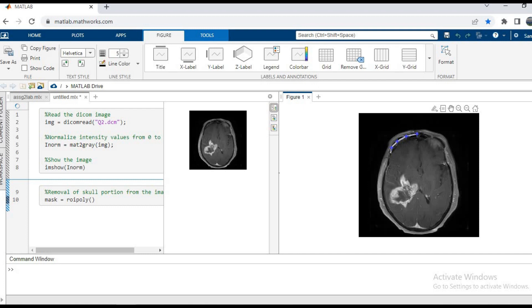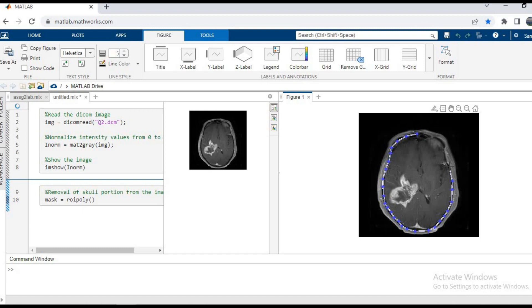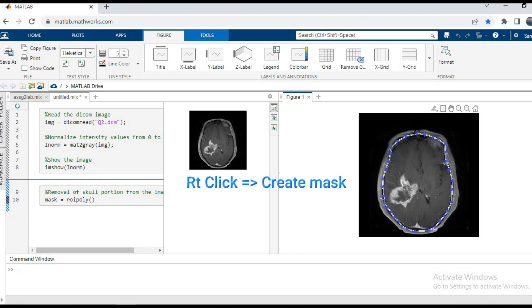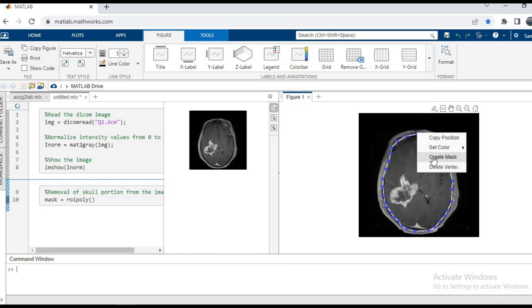We'll use multiple points so that we cover the entire brain tissue and not the skull in the image. Once all the points have been selected I have to close the polygon. When I reach the last point there is a black circle which appears. After clicking on the last point, the polygon is completed. Instead of moving the mouse, we will right-click and select create mask.